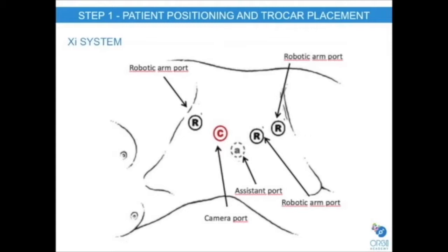For transperitoneal robotic partial nephrectomy, the patient is placed in a modified flank position. For the DaVinci XI, four ports are again used, with the ports placed medially in a more linear configuration.